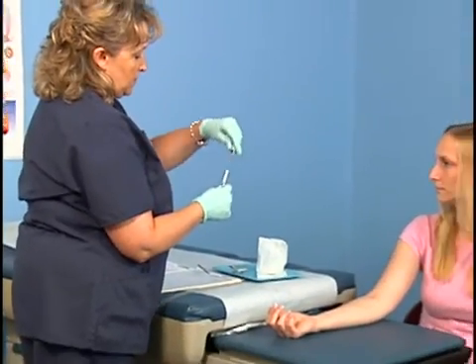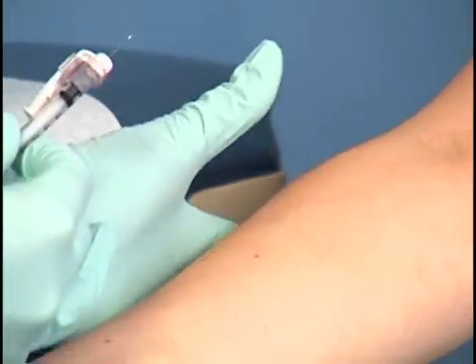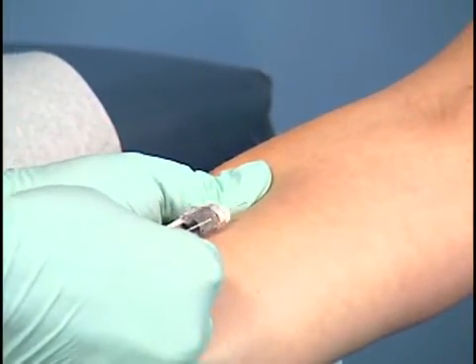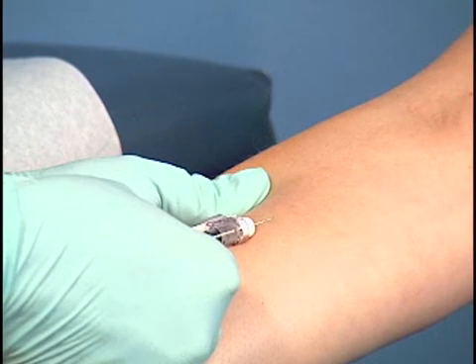Apply gloves and remove the needle guard. With the non-dominant hand, stretch the skin taut. This permits easier insertion of the needle. Insert the needle at a 10 to 15 degree angle, almost parallel to the skin, with the bevel upward. This ensures that a wheal will be formed during injection. The needle should be inserted about 1/8 of an inch until the bevel of the needle just penetrates the skin. Slight resistance may be felt as the needle is inserted.